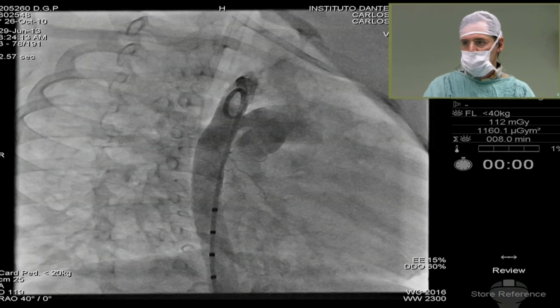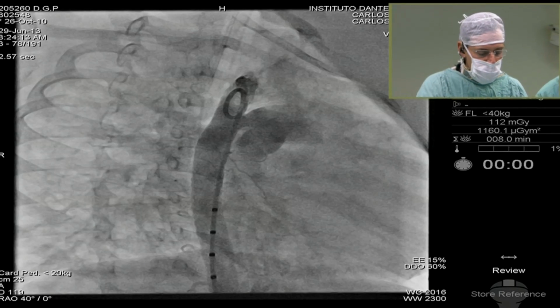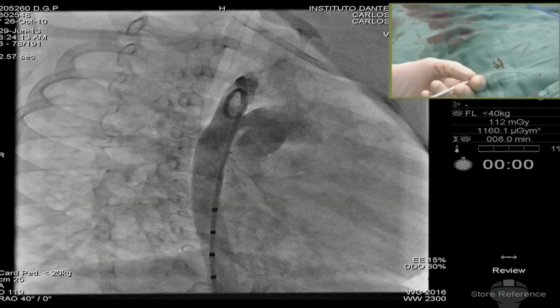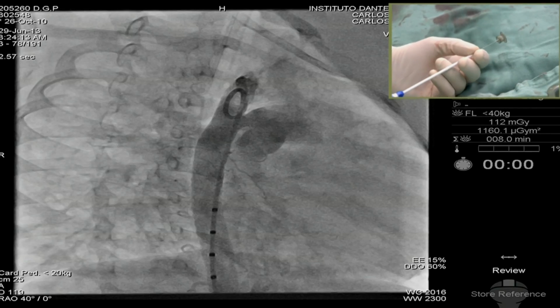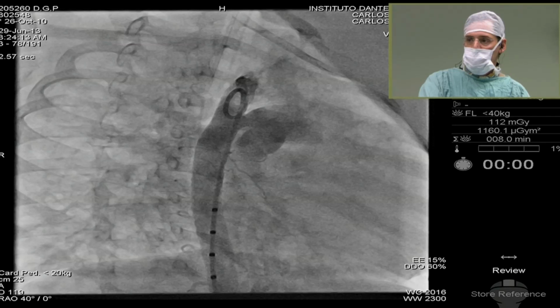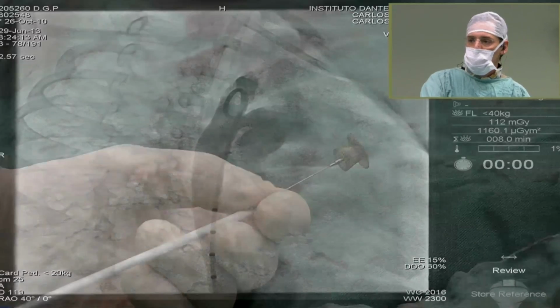Carlos, hey, this is Aid. I was wondering, if you're going to put this 10 device with a 13 diameter on the aortic side, what's the diameter of the aorta itself? That is very, very important, because if the diameter of the aorta is tight, you will develop some narrowing there, right? Yeah, as you can see on the screen, you have the markers.